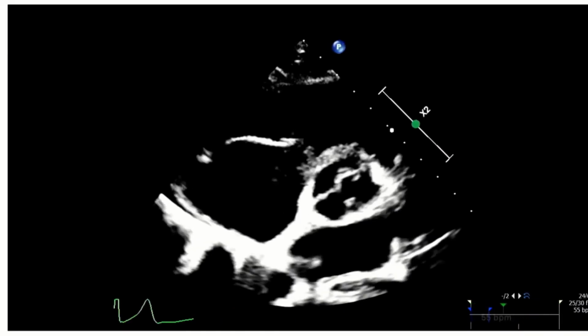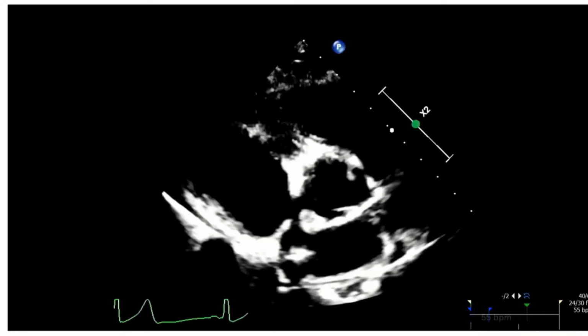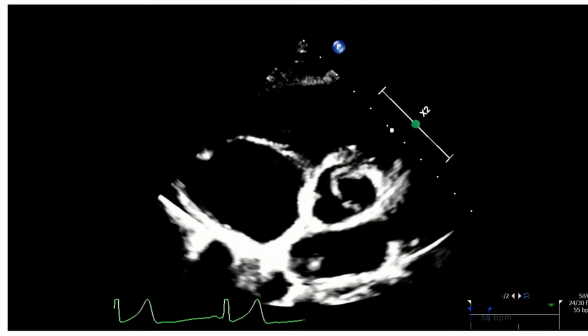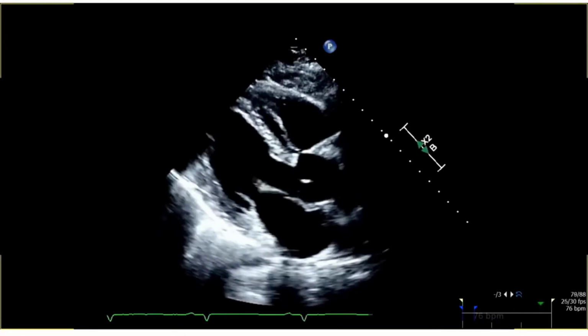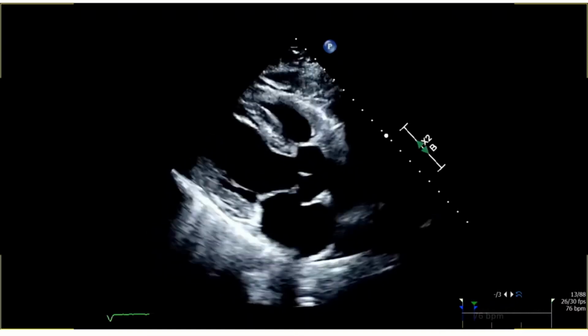This is actually a bicuspid aortic valve. This patient does not have 3 leaflets like the previous patients you've seen. So this is the view where we can differentiate the bicuspid and the tricuspid leaflets. Now again, back to our original picture. Again, the aorta is very well seen there. These are very thin leaflets.